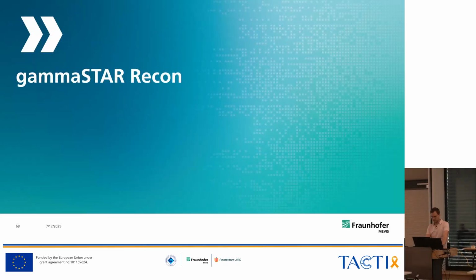to also give us an insight into the gammaSTAR recon work, because that's actually already installed and working with the framework. So all the reconstructed images that you will see in the hands-on part are basically an MR sequence in the gammaSTAR framework being sent to a simulation interface that reads the MR sequence, simulates the k-space based results, so the frequency domain results, and sends the data to Jörn, so to the reconstruction server.